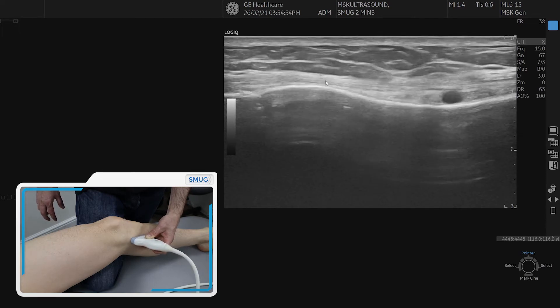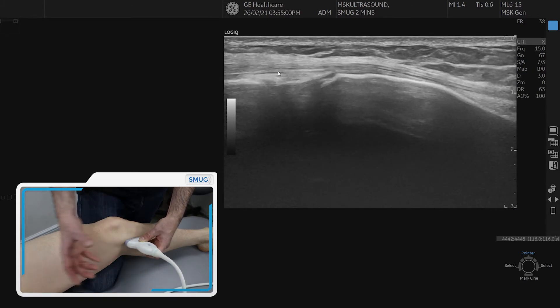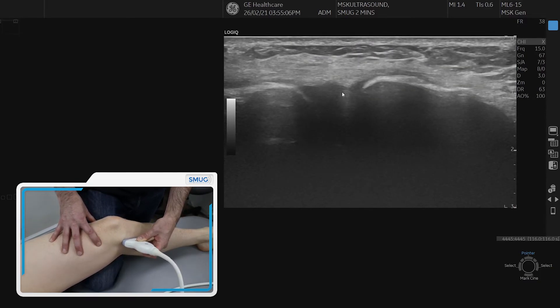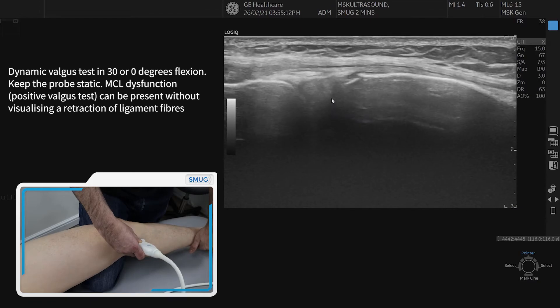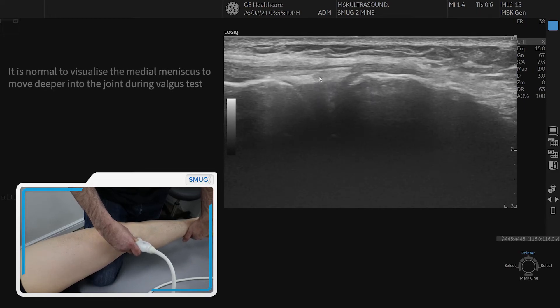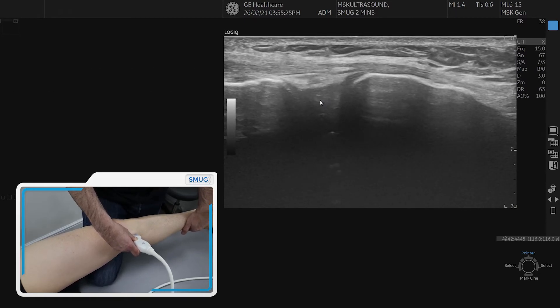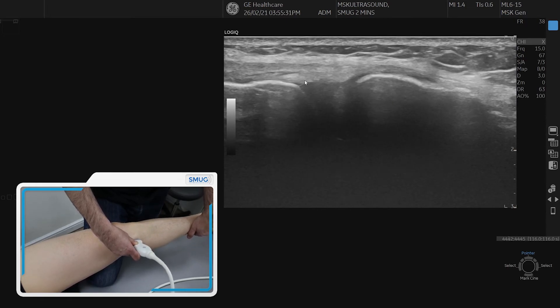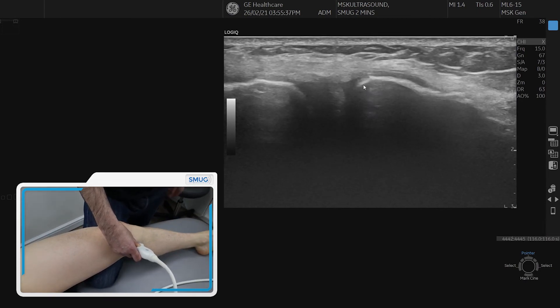We come back to the superficial fibers of the MCL and return to the joint line. We can now do a valgus stress test at any angle of the knee. At the moment the knee is at about 30 degrees of flexion — a comfortable position for the patient, especially with a knee injury — and this gives us the ability to move into extension or flexion. You can see when you perform the valgus test how it draws the peripheral margin of the meniscus into the joint, and you can feel how the MCL tightens up. You can see the joint widens during the test — this is a dynamic assessment of the MCL under ultrasound guidance.